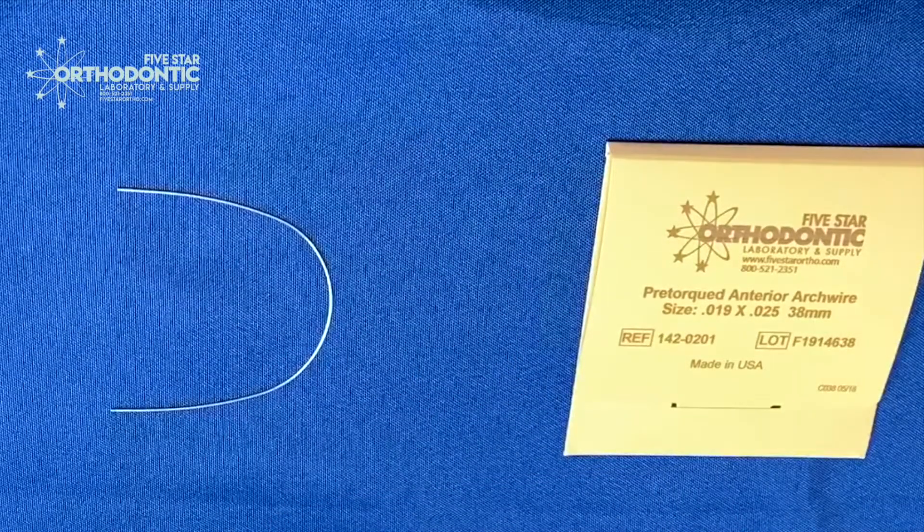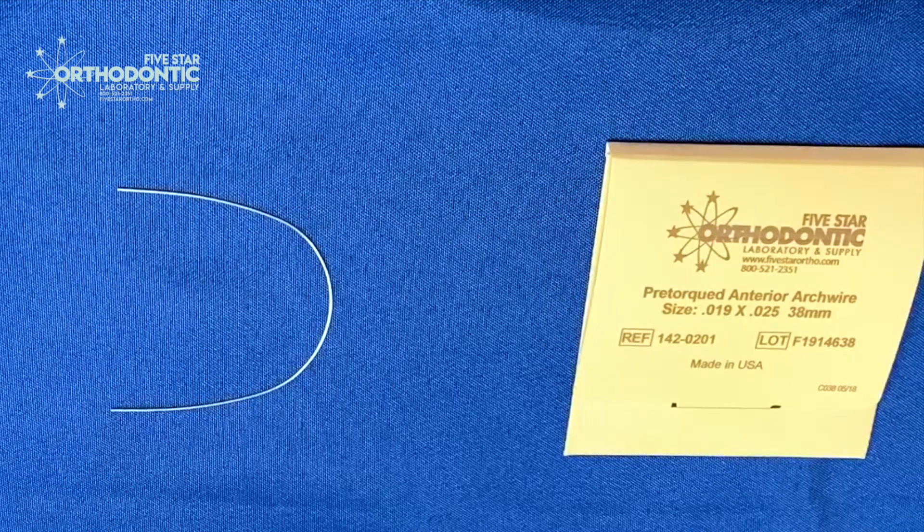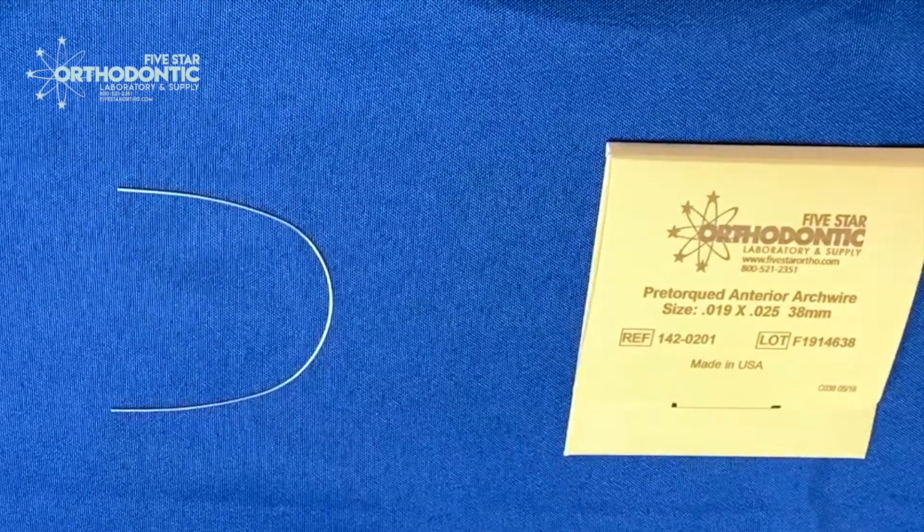So this is our pre-torqued wire. It comes with an extra 20 degrees of torque in the anterior segment. You can buy these in a pack of five from our supply department here.